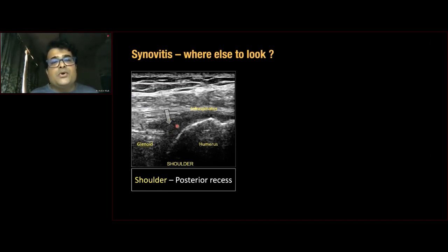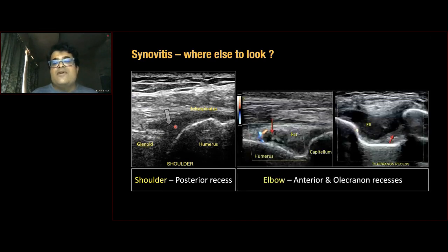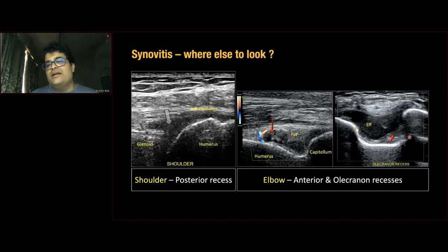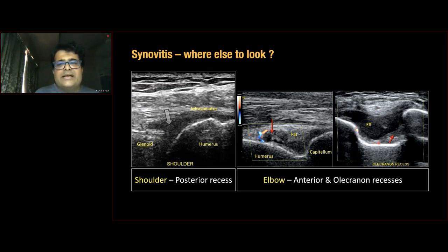For the shoulder, look for synovitis in the posterior joint recess between the glenoid and humerus. For the elbow, look in the anterior joint recess — shown here is the humerus with an anterior fat pad and joint effusion with synovial hypertrophy. Posteriorly, the olecranon fossa shows effusion and anterior displacement of the posterior fat pad with mild synovial hypertrophy. These are relatively easy joints to scan.